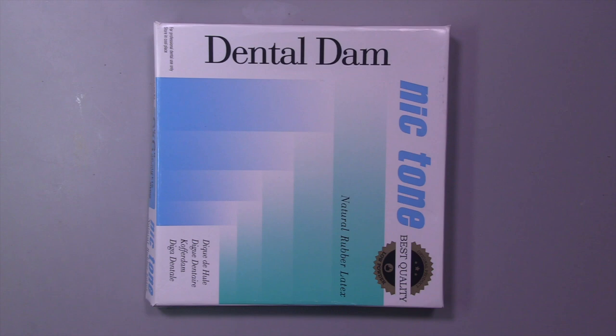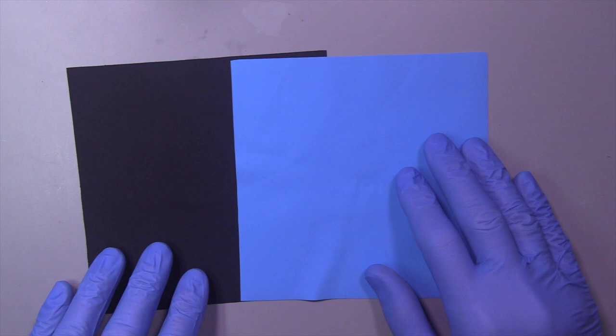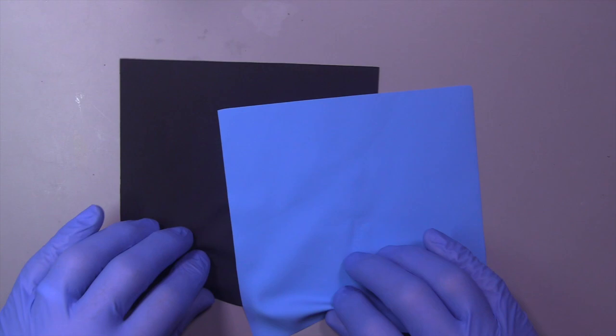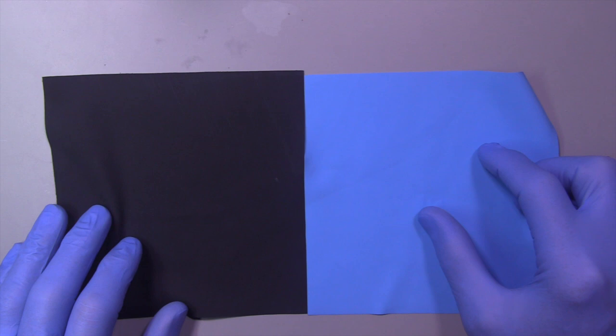My favorite rubber dam is Nic Tone. Nic Tone has three colors: they make a black, a green, and a blue. I just like the black and the blue personally because I think they photograph well — but that's just my personal preference. They're all six by six inches; they also make a five by five, and they make them in various weights: light weight, medium weight, heavy weight. I like the medium weight — it seems to work well for most procedures.